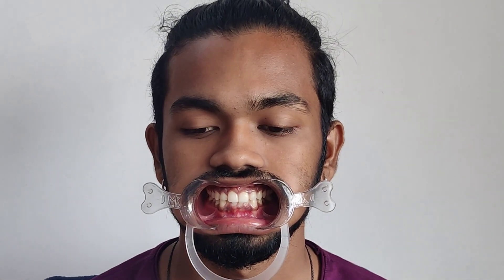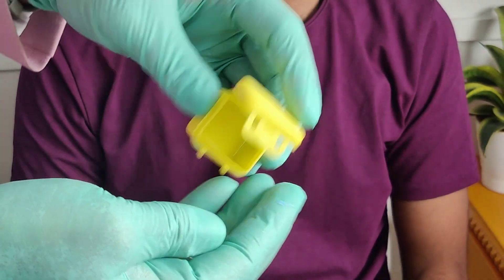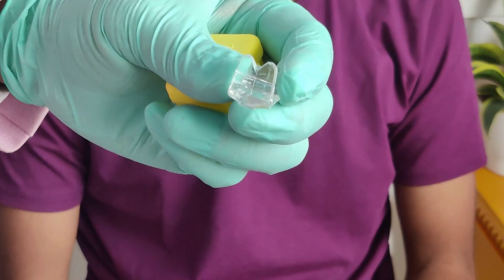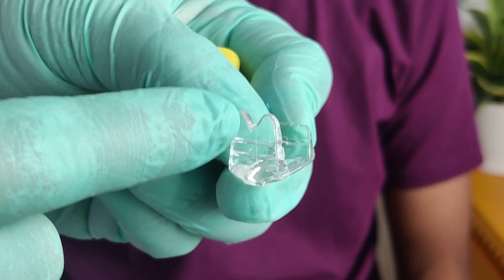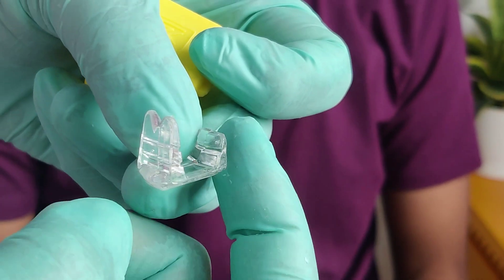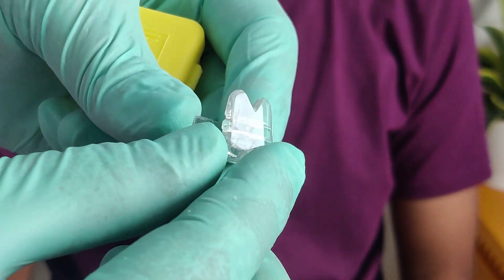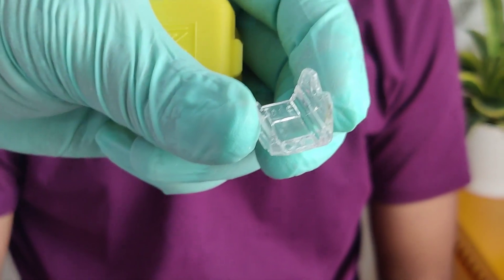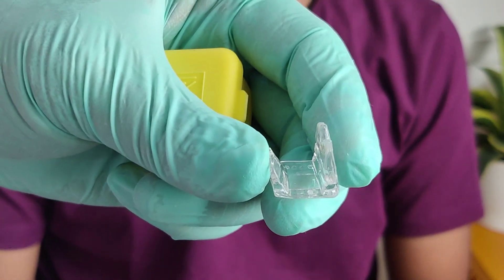It is best to customize the Unwind MD with the Panorama view, retracting the cheek open. This is how Unwind MD is provided commercially — it comes in these carry case boxes. The front end is the taller end and has a groove for the labial frenum. The back end is the shorter end for the palatal surfaces, and it's the internal surface — the hollow chamber in the middle — that we reline with either a bite registration paste or with a hard-setting cold cure acrylic resin.